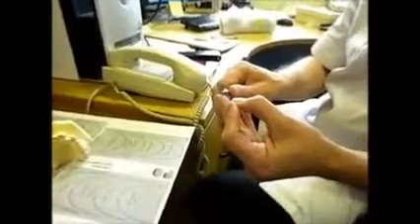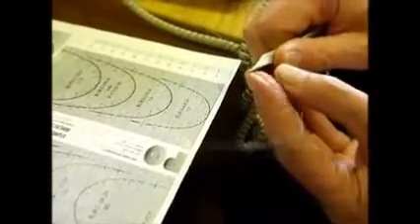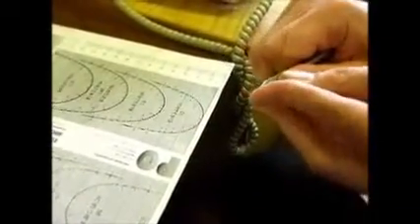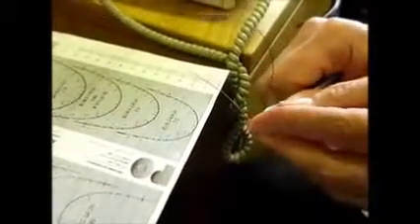So the thing to do is you've got the beaks, the square beak and the round beak. You want to bend the right angle bends around the square beak to start with, and so you just bend that up like that. Now you have to be careful with this wire because it's very brittle. Do you overbend it to get it at 90 degrees? Well, you bend it to 90 degrees so that it goes up at 90 degrees.